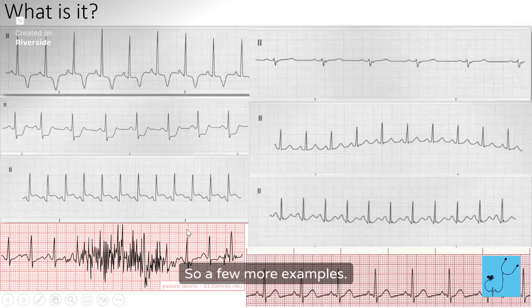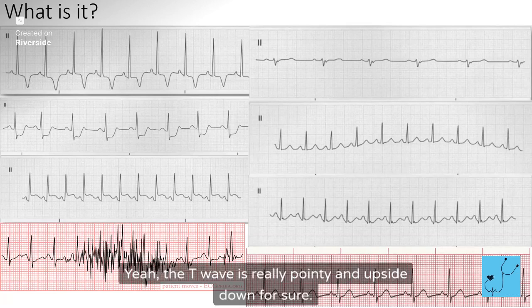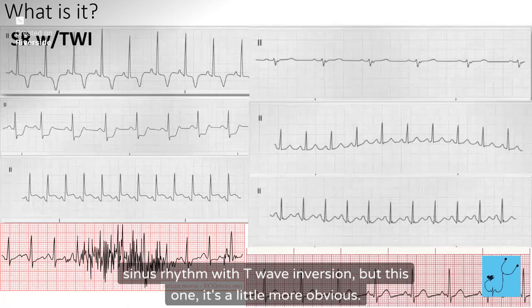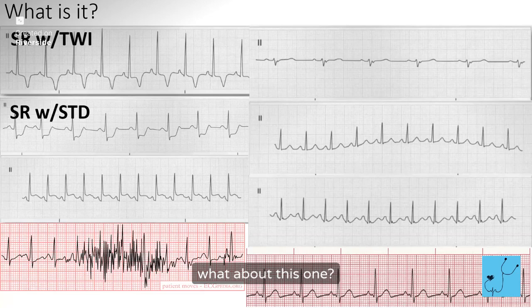So a few more examples. What about this one here? That first one. What looks funny there? Yeah, the T wave is really pointy and upside down for sure. So sinus rhythm with T wave inversion. What about this one? It's a little more obvious. Yeah, ST depression for sure. And it's pretty significant. So what about this one? ST elevation, yeah.